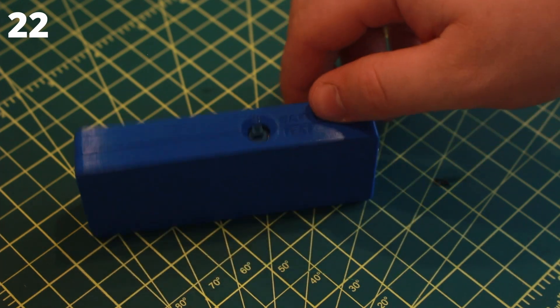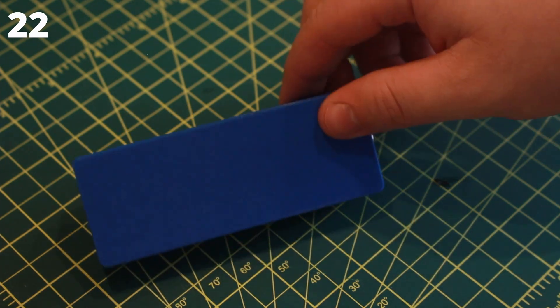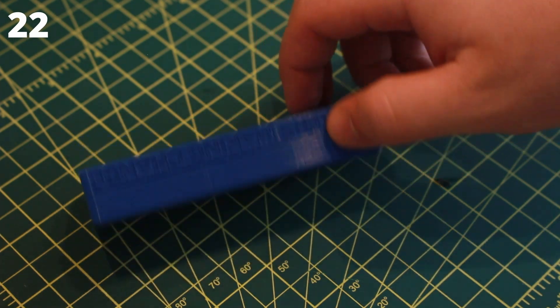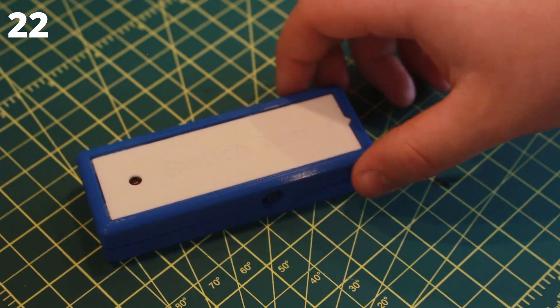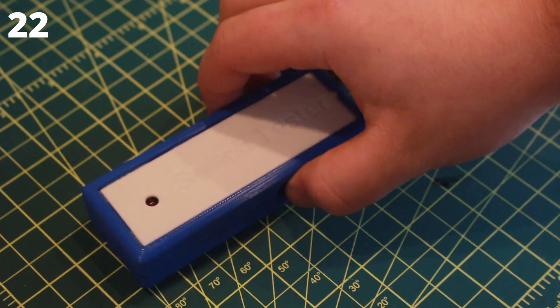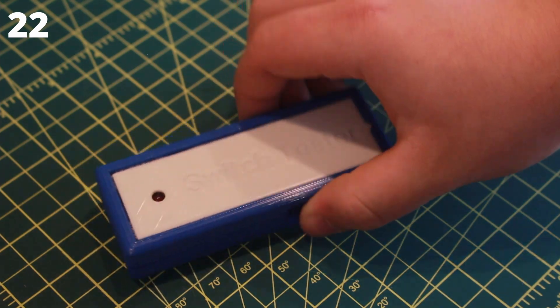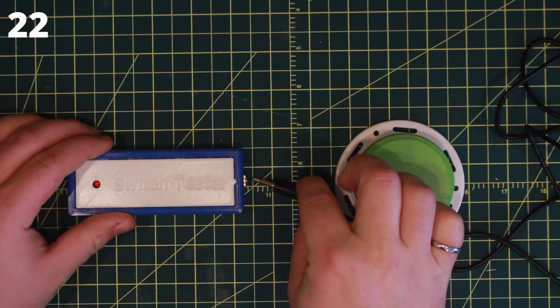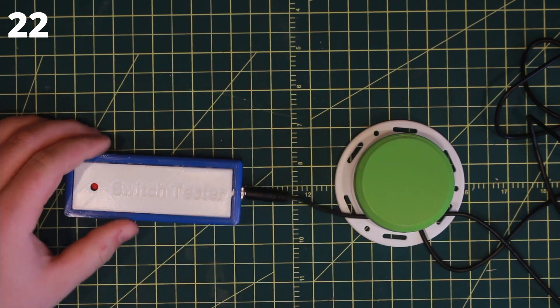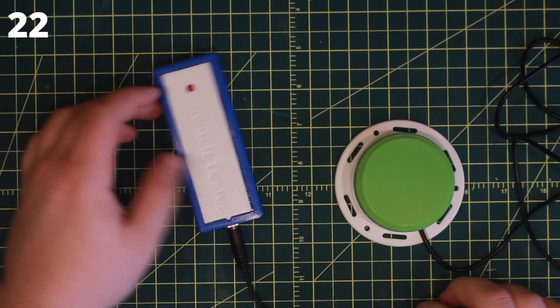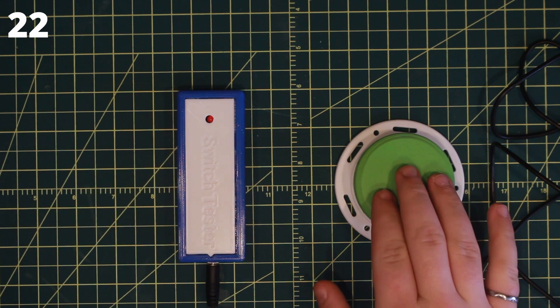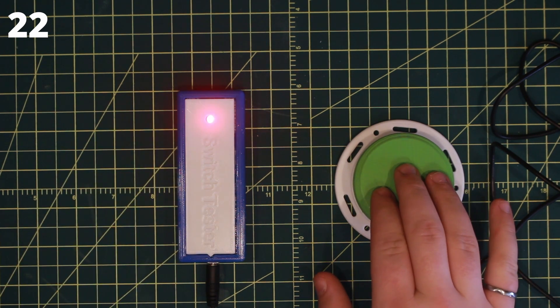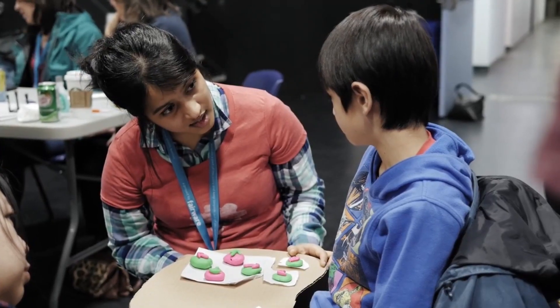The switch tester build is now complete. Test it out by pressing the tactile switch on the side or plugging in an external switch to light up the LED. This device can now be used to test if an adaptive switch is working.